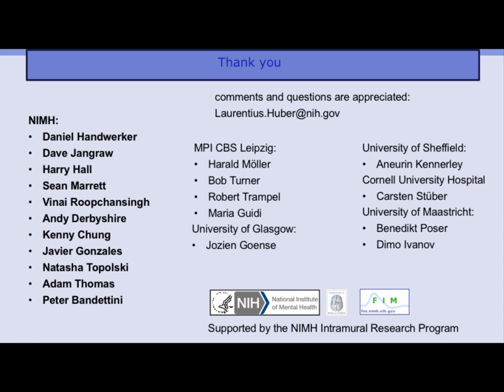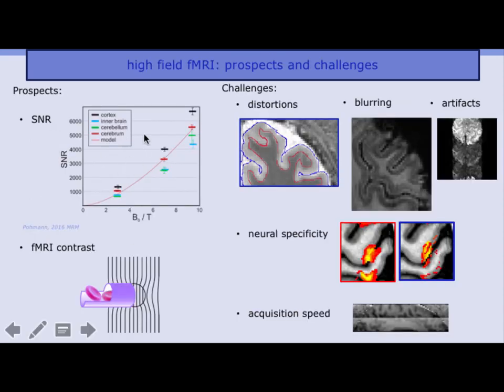Okay. I'm supposed to repeat the question for the mic. So Sam asked about limits in the temporal resolution at high fields. And I'm not 100% sure if I get it correctly. The increased SNR that we get at very high field strength can be traded for anything. You can use it for higher acceleration factors, for example, more GRAPPA, more SMS, which reduces your TR, and then you have effectively a higher resolution at the end.